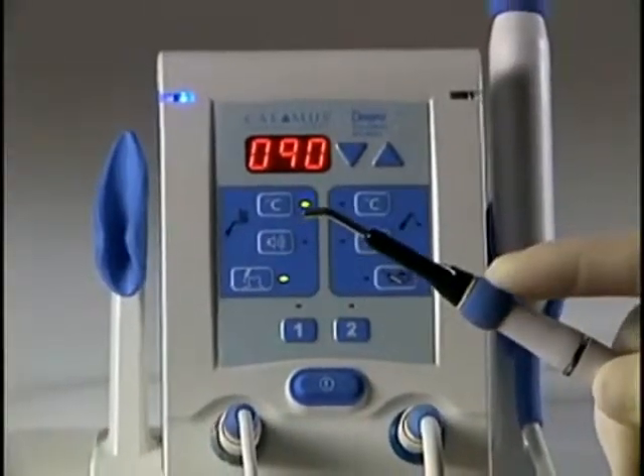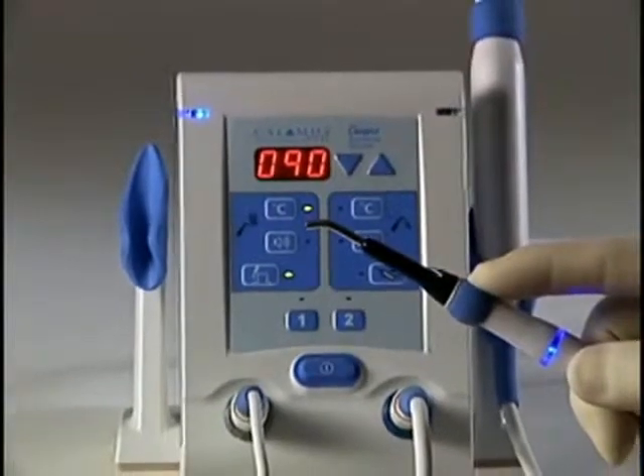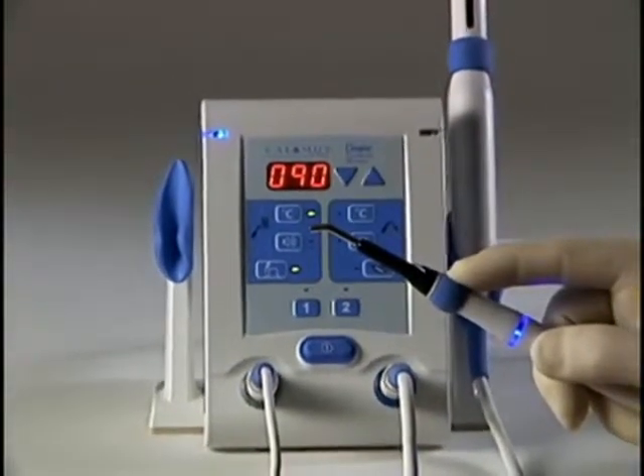The thermal response tip will heat for 1 minute while the 360 degree activation cuff is depressed.